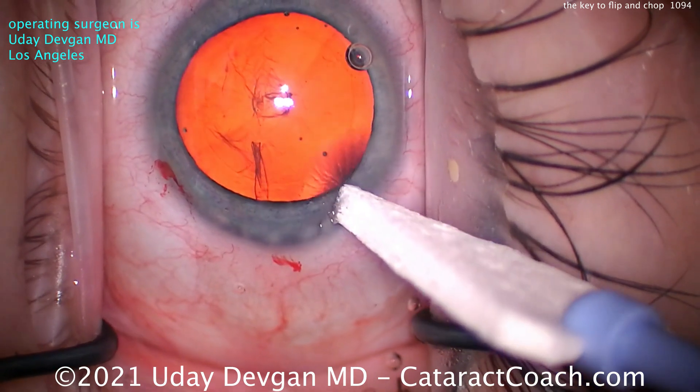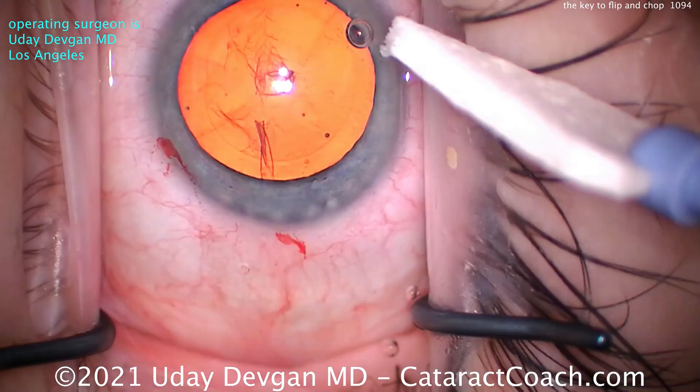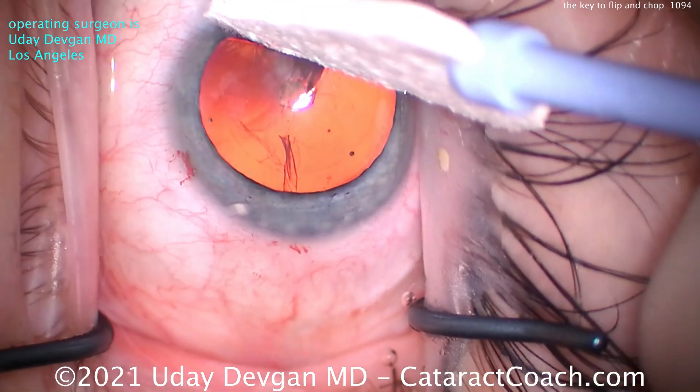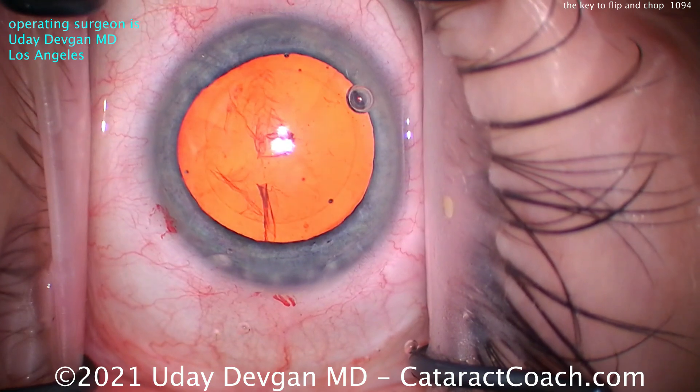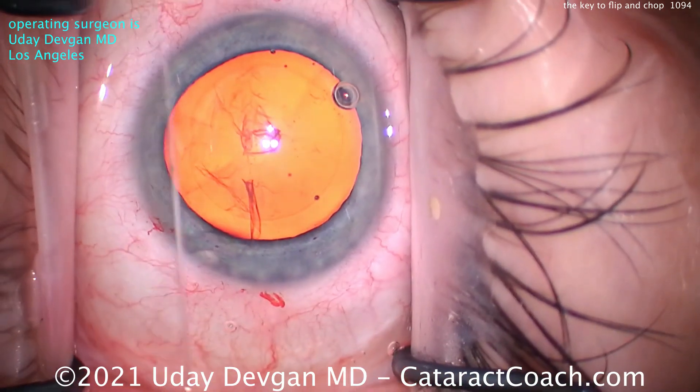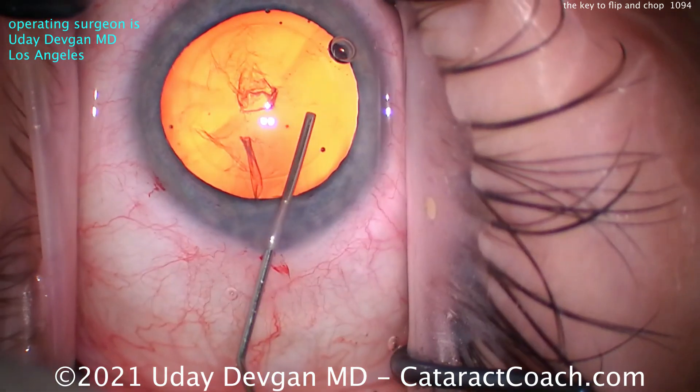Now I'm using a sponge here to show you this patient has a little LASIK flap — you can see the edge of it when I push the sponge in certain gradients. But we've already taken that into account for our lens calculations, so let's get on with the case.